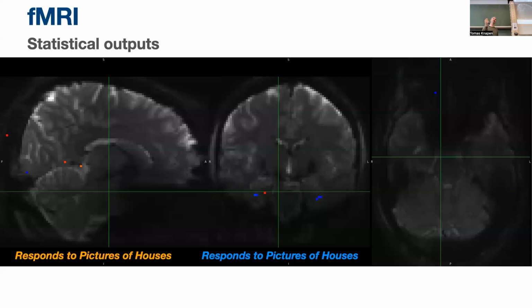You're looking at the end result of a statistical analysis, where it's not a BOLD response or percent signal change or neural activation. You're looking at a statistic, most likely some form of t-statistic. Those of you that are statistics aficionados will get to your hobby of choice in later lectures primarily.